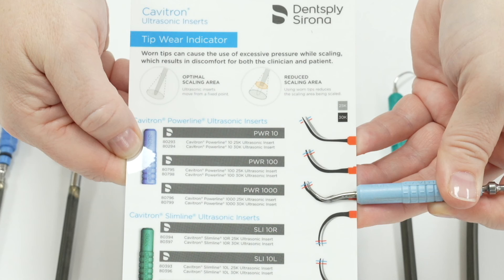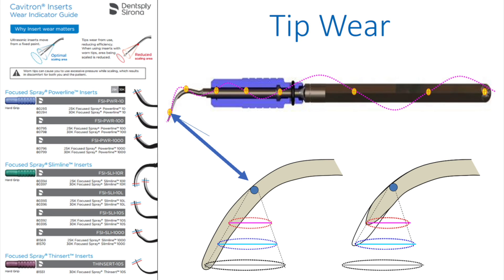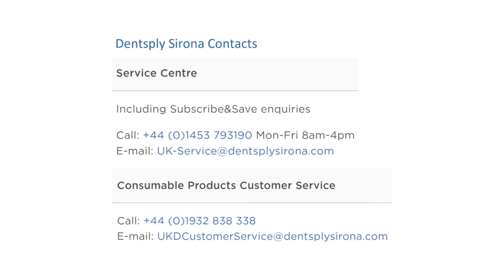To measure a 25k insert you go through the same process but hold the insert along the grey line. This 25k insert is a Powerline 1000, which you can see here on the card. Insert measurement guides come with the purchase of an insert or a Cavitron; however, you can also contact your local Dentsply Sirona account manager or our service department and they will arrange to send out more guides for you.